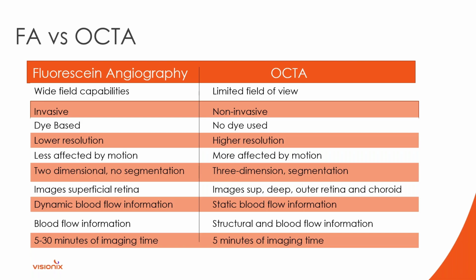The other thing we know is that fluorescein requires a dye where OCTA doesn't, so that's obviously a perk of OCTA. OCTA actually provides better resolution than FA, and I'm going to show you that in a few minutes when we start going through examples. You can see things on OCTA that you can't see on fluorescein because you do not get any leakage on OCTA, and we'll talk about that in just a minute.